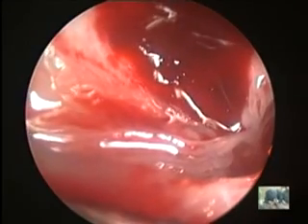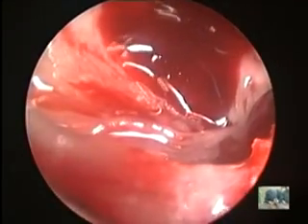Actually, we don't see much disease inside. Yeah, just some blood.